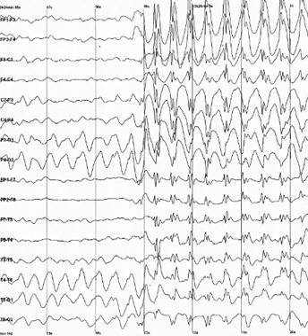The other popular offline references are REST reference, which is an offline computational reference at infinity where the potential is zero. REST, reference electrode standardization technique, takes the equivalent sources inside the brain of any set of scalp recordings as springboard to link the actual recordings with any online or offline average, linked ears etc. non-zero reference to the new recordings with infinity zero as the standardized reference.